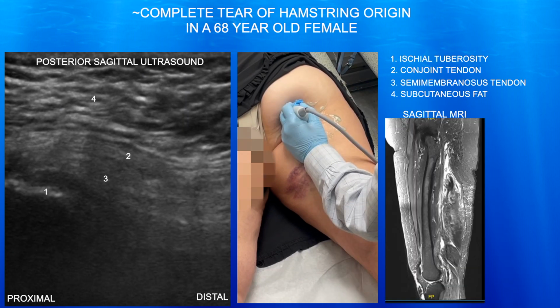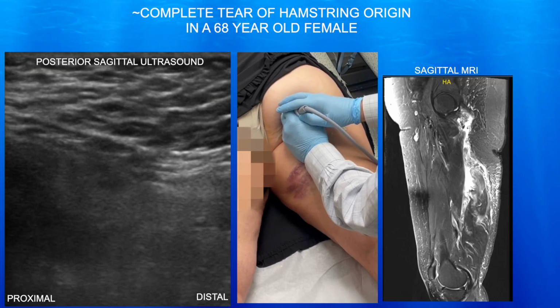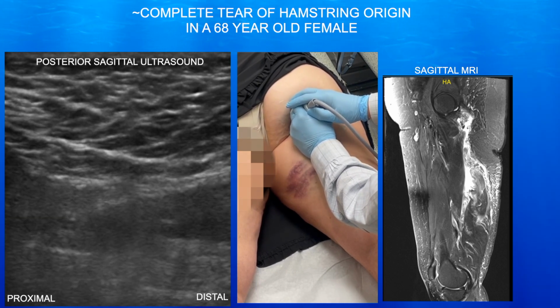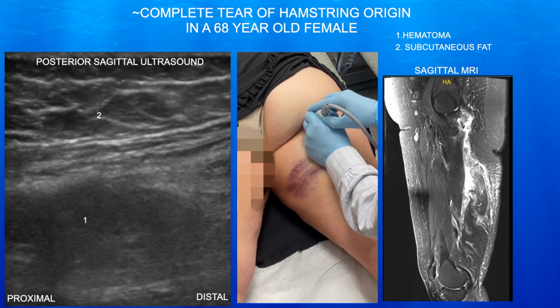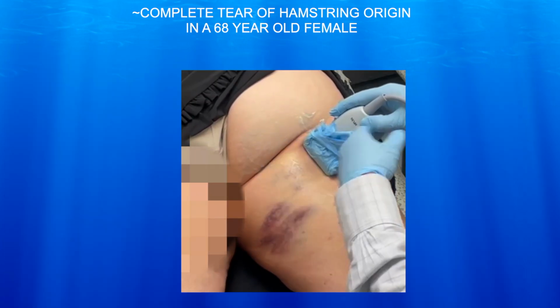Here we're going a little bit lateral, and it actually looks like there are some continuous fibers going towards the ischial tuberosity, but the question is whether these fibers are still continuous with the muscle distally, and it seems like this is essentially just about a complete avulsion of both the conjoint tendon and semimembranosus tendons. Here we're going a little bit distally again. You can see this large fluid collection consistent with this hematoma, and occasionally you can try to drain these hematomas, but once they start organizing, you're really not going to get much fluid out.